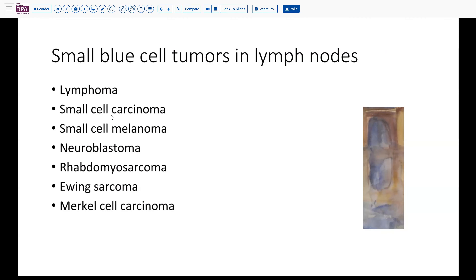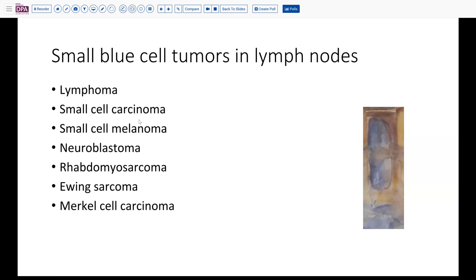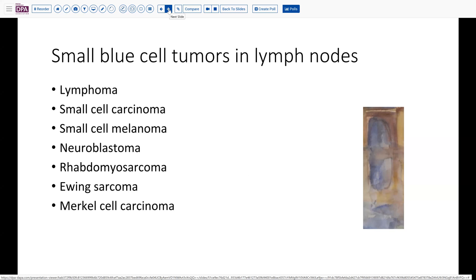Small cell carcinoma certainly would be a consideration. Melanoma. Neuroblastoma in a different age group. And similarly, rhabdomyosarcoma or Ewing sarcoma — these would primarily be in a pediatric age group. But Merkel cell carcinoma certainly could be in this patient age group as well.